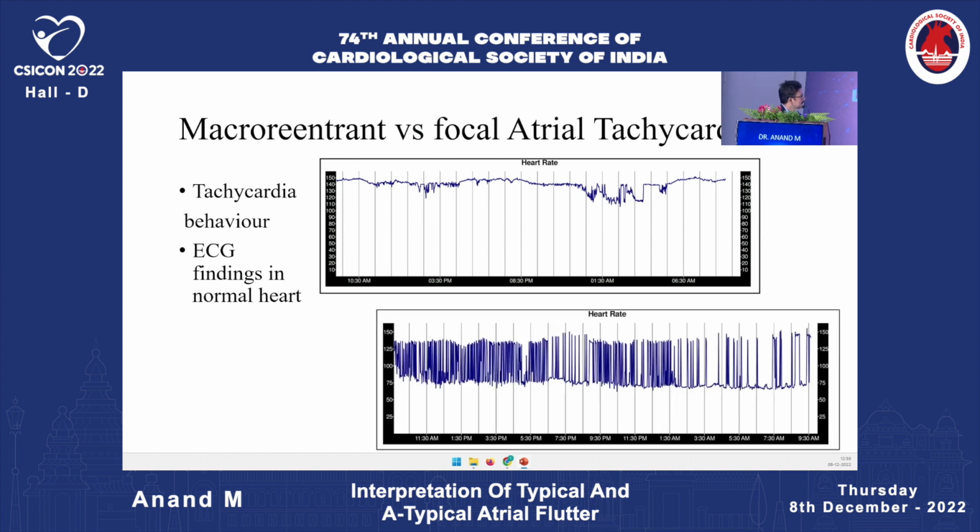On the other hand, this was a patient with a focal AT arising from the pulmonary vein focus. Here, this was the baseline sinus rhythm, and suddenly it occurs in bursts. The rate rapidly increases like that. So this is one of the ways focal AT can present, or focal AT will usually have warm-up and cool-down phenomenon present. ECG findings can be interpreted only in patients with normal heart.